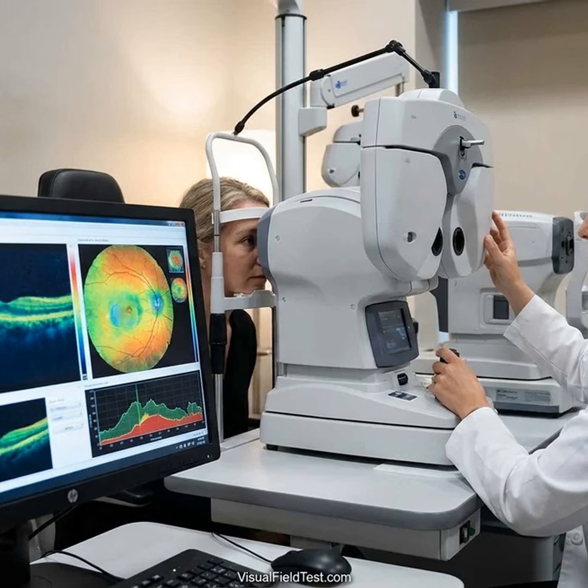Key OCT findings in moderate glaucoma include progressive RNFL thinning. Sustained drop in the average RNFL thickness or in any quadrant is concerning. Studies call a loss of more than 2 microns per year in RNFL after baseline rapid thinning, and a warning sign. This is much faster than natural aging, around 0.3 microns per year, so if your OCT shows more than that, your doctor will take notice. New sector losses. If OCT color maps show a new red or very yellow sector that wasn't there before, that indicates a new nerve fiber bundle has thinned. Even if it's small, this is important to recognize.